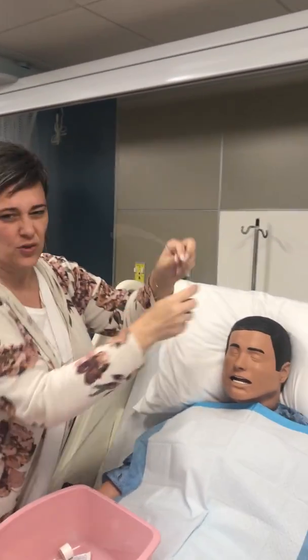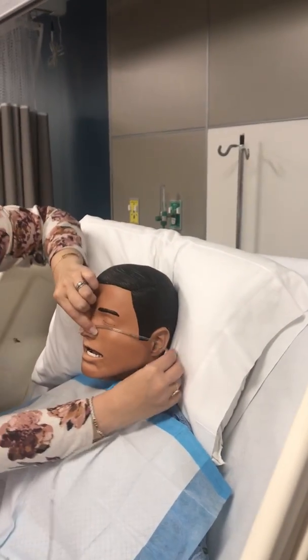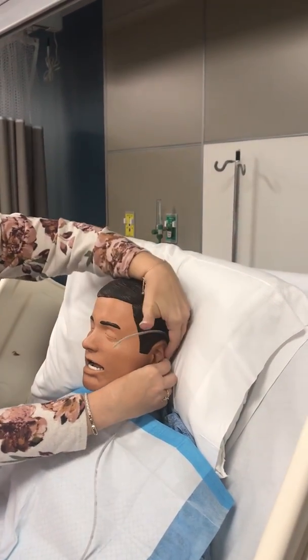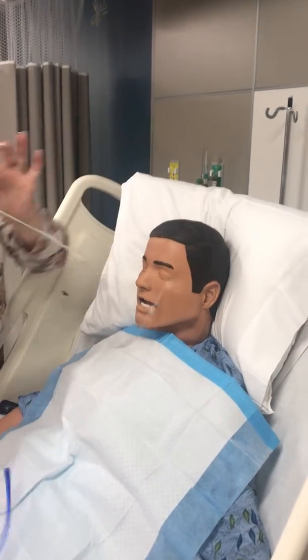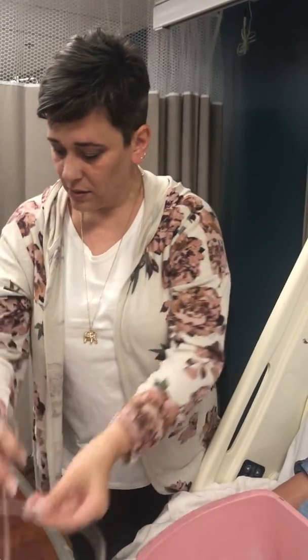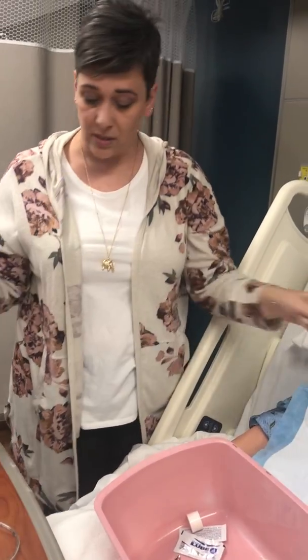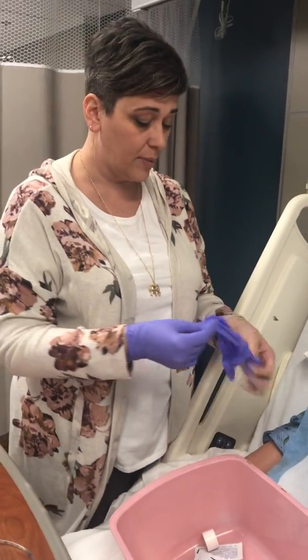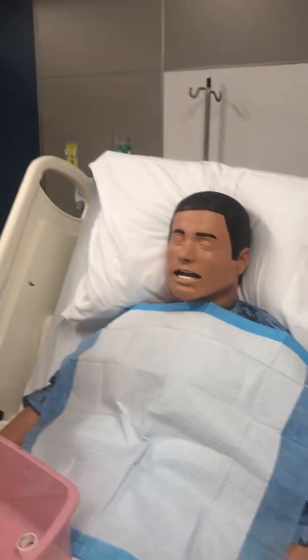I'm going to measure this — tip to tip around the ear and then down to the xiphoid process, which is at the base of the sternum. I'm going to mark that area with a piece of tape so I don't go past it; that's what I'm going to insert to. Then I'm going to sanitize again and get my gloves on. The patient has a basin and a blue pad because they will most likely vomit if it's a bowel obstruction. The absorbent side is out so it soaks it up instead of running down onto the gown.